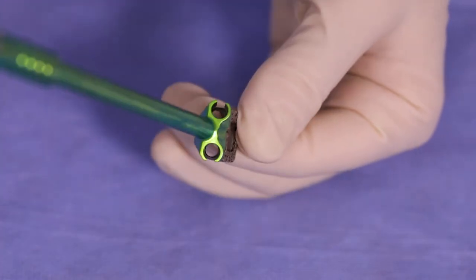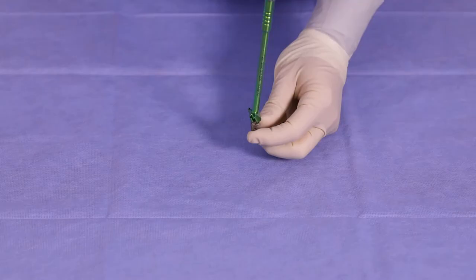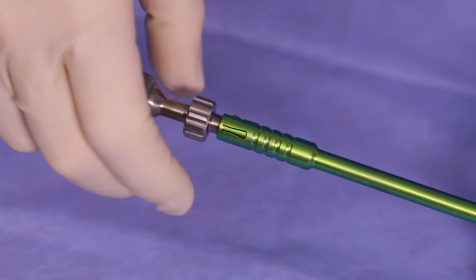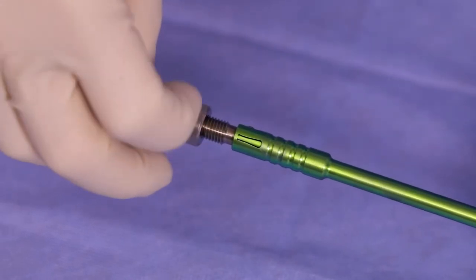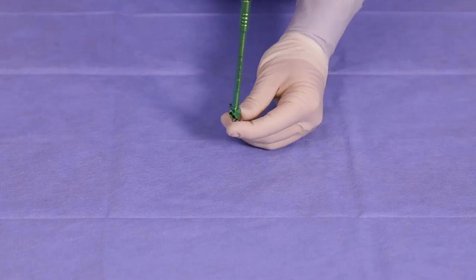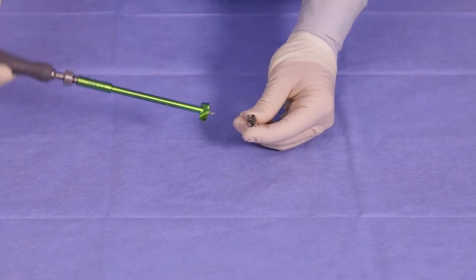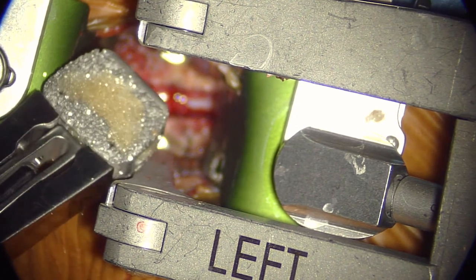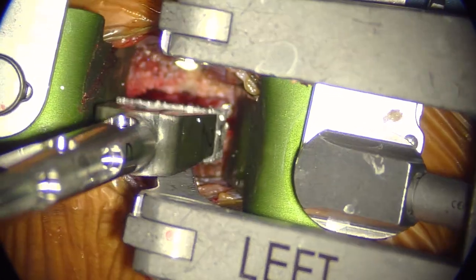Once both outboard screws are in place, the cervical inserter can be removed by rotating the knob located on the proximal end counterclockwise. Tip the inserter toward the angle of the center screw and pull backwards to remove the inserter from the cage. Once the cage has been properly loaded onto the chosen inserter, it is ready to be implanted into the disk space.